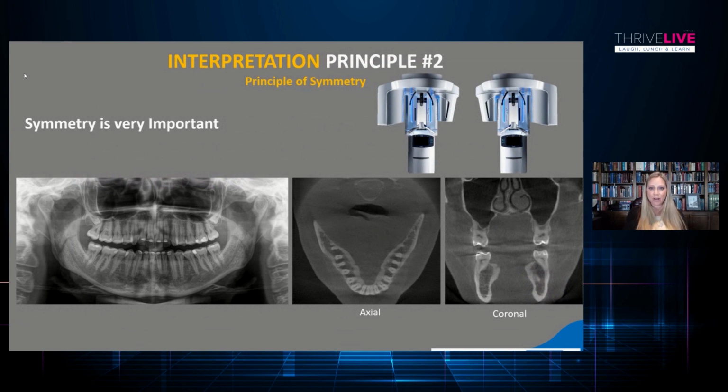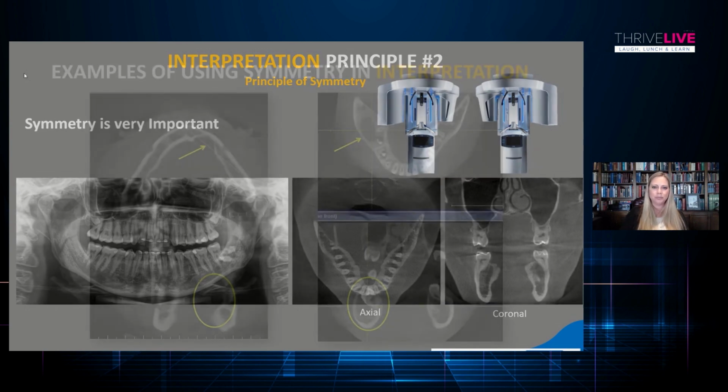The best part about radiology is that it doesn't smell. So it's a lot more fun than going through our anatomy and cadavers and that sort of thing. But I think this is a really easy and simple method to start out looking through everything.